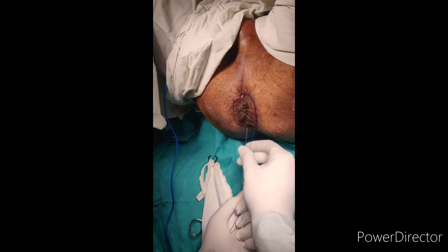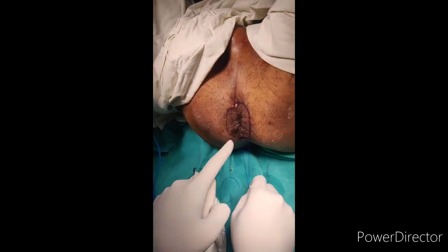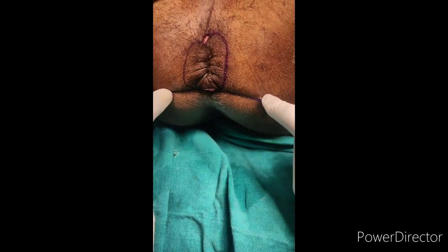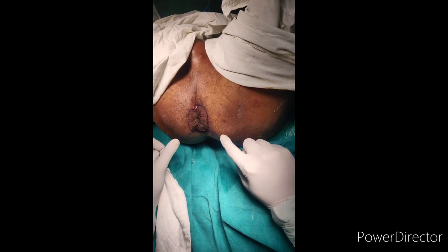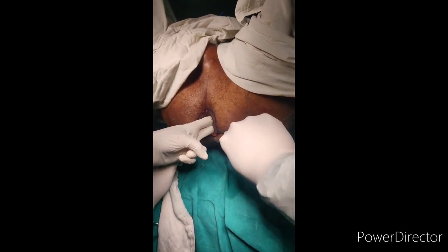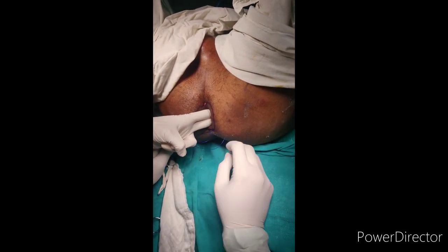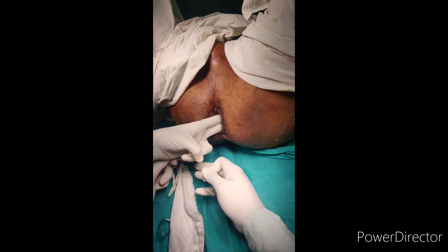On the table we can see that a complete band has been formed. During this step you have to keep two fingers inside so that the anal opening is not tightened, so that the patient will not complain postoperatively. You will tell your assistant to keep two fingers inside and then tighten the knot. This forms a non-absorbable band or suture, and there will be less chances of prolapse postoperatively.